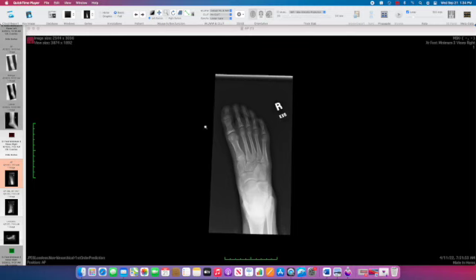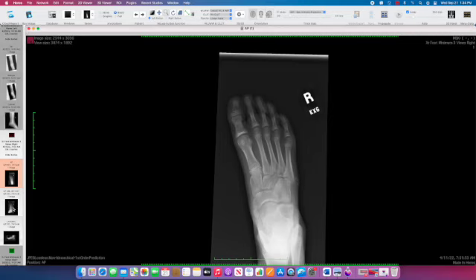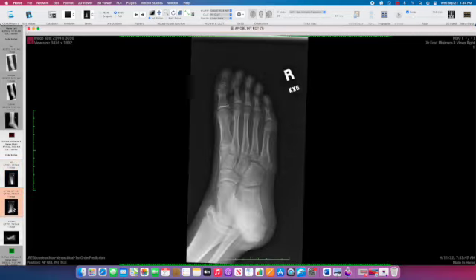We can enlarge the AP radiograph. Here at the base of the fifth metatarsal, we see linear ossification. We go to the oblique radiograph. We again see an area of linear ossification. It's paralleling the fifth metatarsal base.